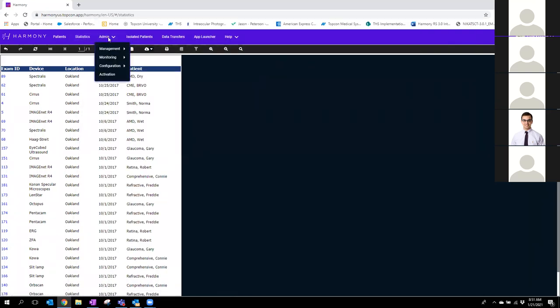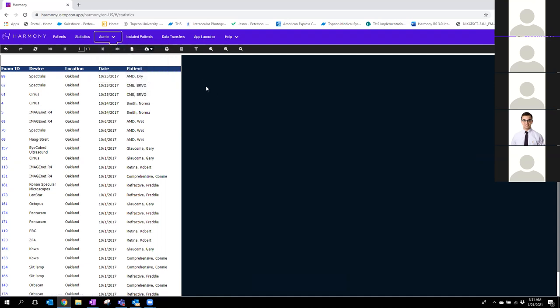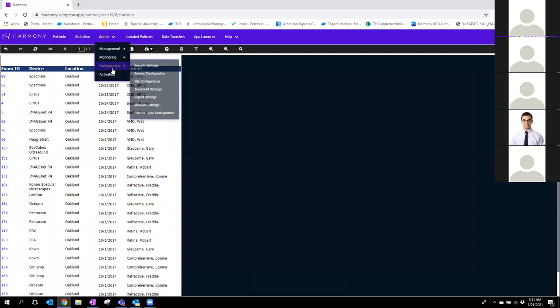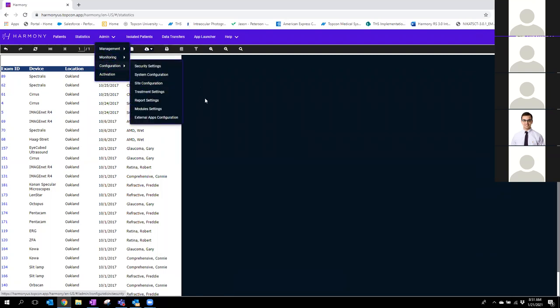An administrator has the ability to add user roles and user accounts. Roles and users are actually different — a role can be technician, scribe, doctor, or admin. All those different roles are assigned to user accounts with different permissions to access certain menu items. For example, a technician or provider may not need to access stuff in the admin menu, so those could be turned off. If turned off, when they click on admin it would just look blank. You can lock certain roles out of certain menu items.